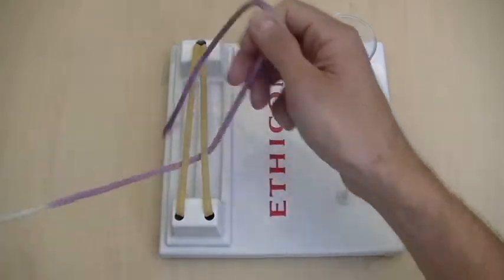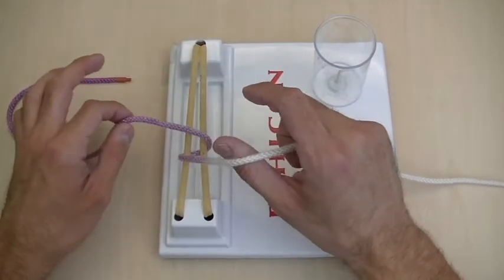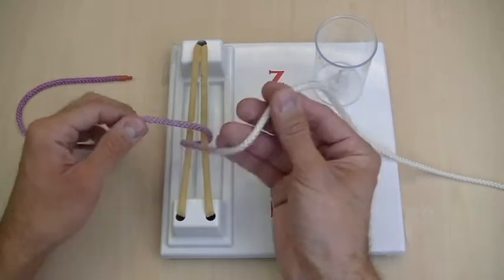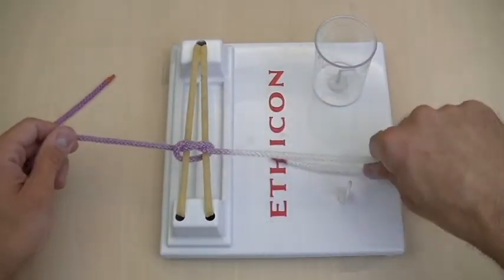Now, if I were going to tie with my right hand, a two-handed knot would start with the thumb because both the white string and the thumb are closest to me. But if I'm going to do it one-handed, I want to do an underhand throw, which looks like this. And I'm laying down a nice square knot.